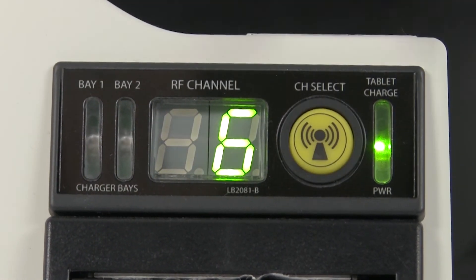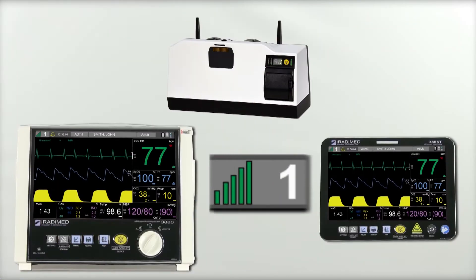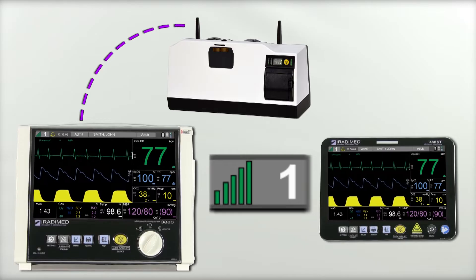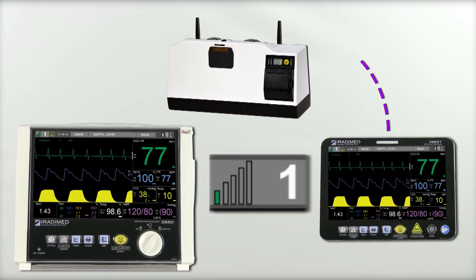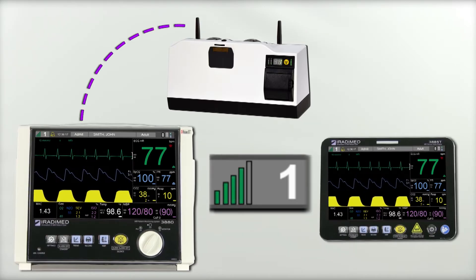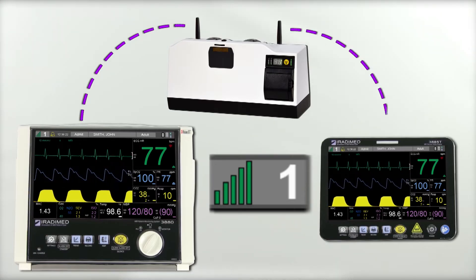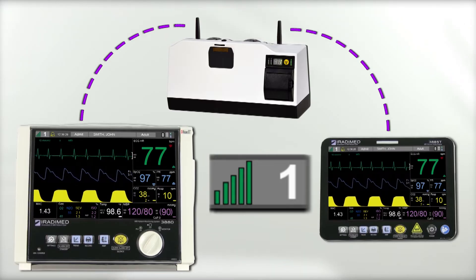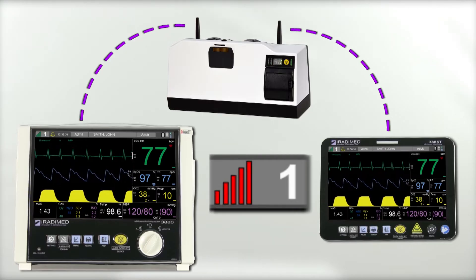Once the control room components are on the same channel, confirm the wireless synchronization with the 3880 by checking the signal indicator on the top left. The signal indicator represents the strength of the wireless connection between the monitor and the base station, and the strength of the wireless connection between the base station and the tablet. The number of bars shown indicates the connection strength between the monitor and the base station, while the color of the bars indicates the connection strength between the base station and the tablet. Green bars indicate a strong wireless connection, yellow bars indicate a medium strength connection, while red bars indicate a weak connection.